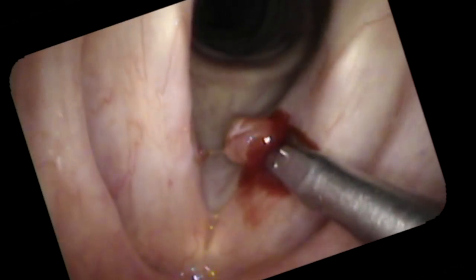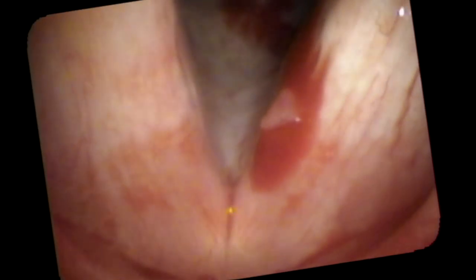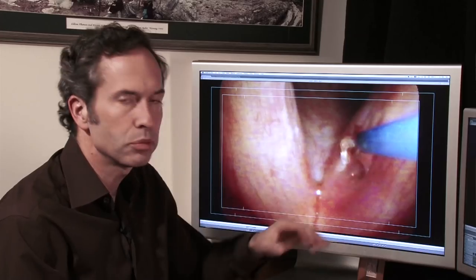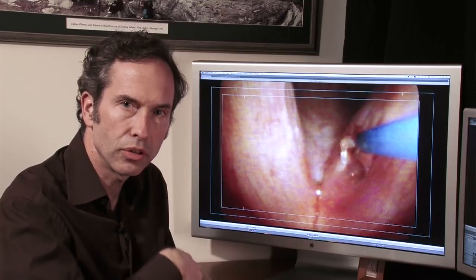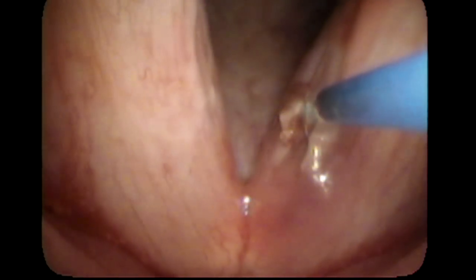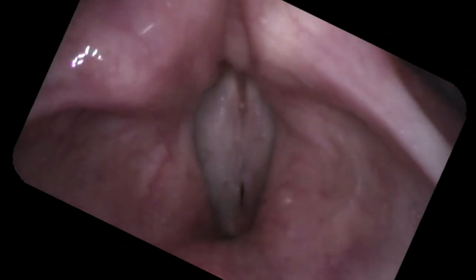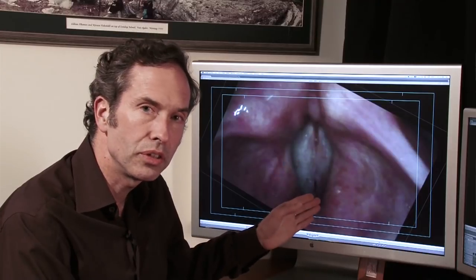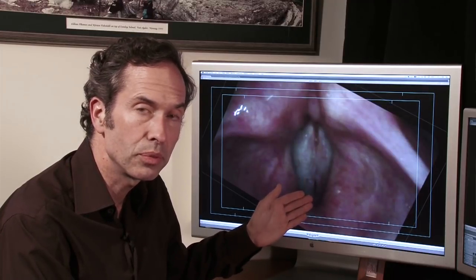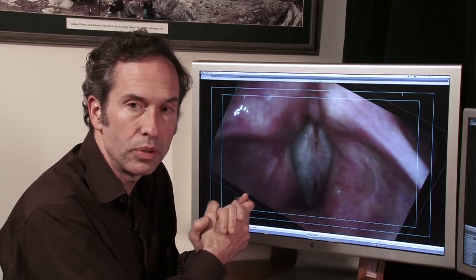It bleeds because it has a blood supply. At the end he's got a little skin tag hanging off, so we're going to use a laser — a light beam passed through a flexible fiber through the endoscope — to ablate some of that excess tissue. Here he is a month later. That area has healed and we want to see how flexible it is. He's still got a little skin tag on the left side and it's a little stiff, but this is only one month later. It should continue to soften with time, and continued voice use will help improve flexibility.